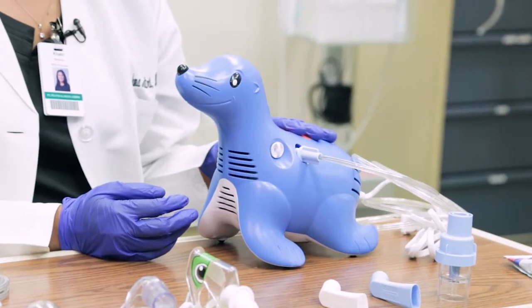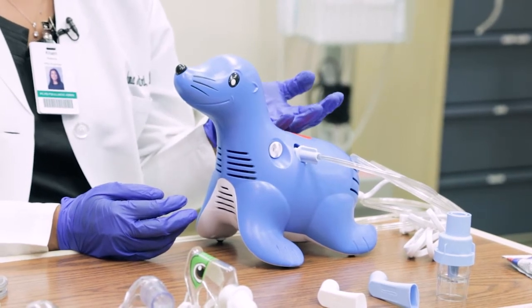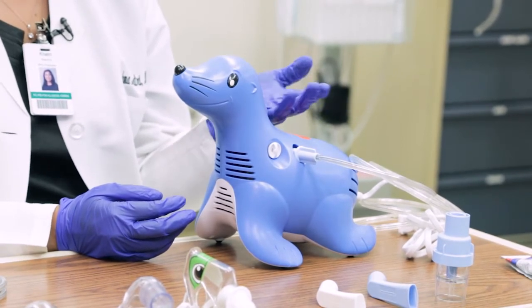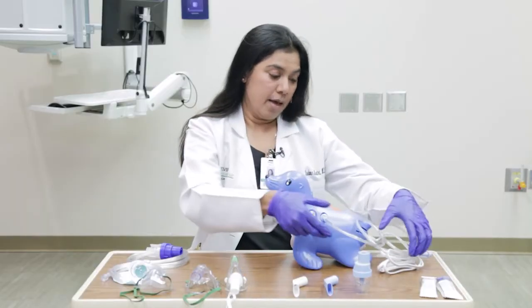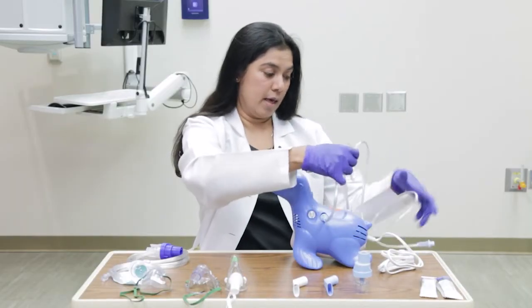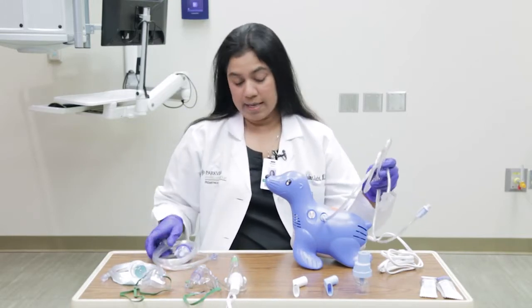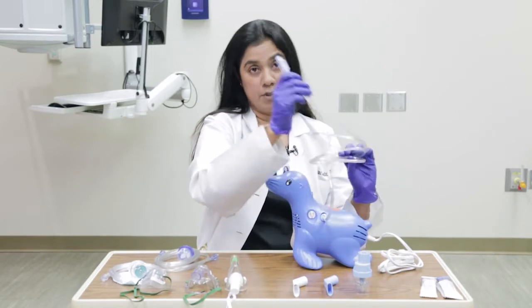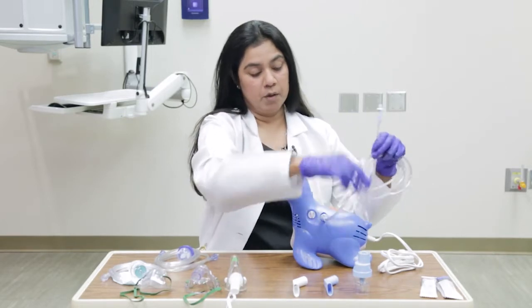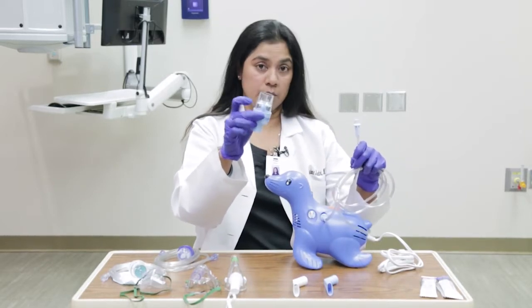This is one of the typical machines that your doctor might prescribe for you if your child has asthma, or he or she is wheezing from RSV bronchiolitis, or for any other reason. This machine has a compressor, and this is the tubing that typically comes separately. You would attach the tubing to the machine, and this is the other end of the tubing, which goes into the small container into which the medicine actually goes.